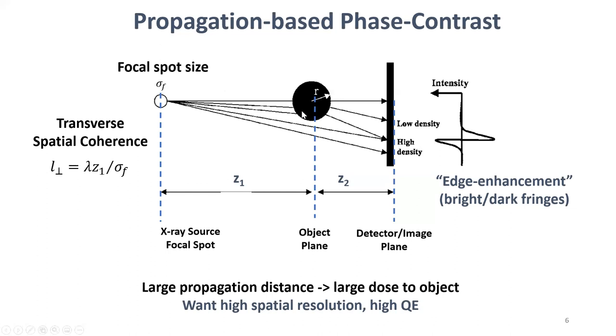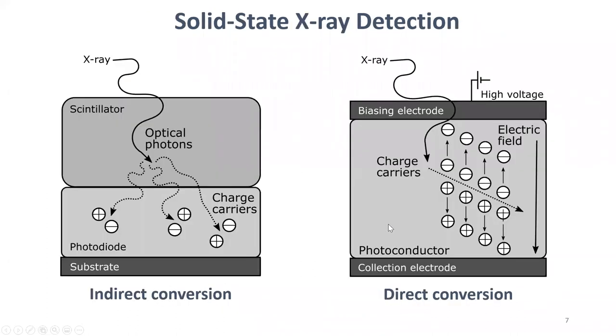You can do this, I mean, literally with minimal effort in setup. You don't have to worry about vibration in the systems because the detector and the source, it's like a simple X-ray cabinet. So that's the area we went down, and we said, let's take a look at the various types of X-ray detectors out there and the ones that we wanted to focus on.